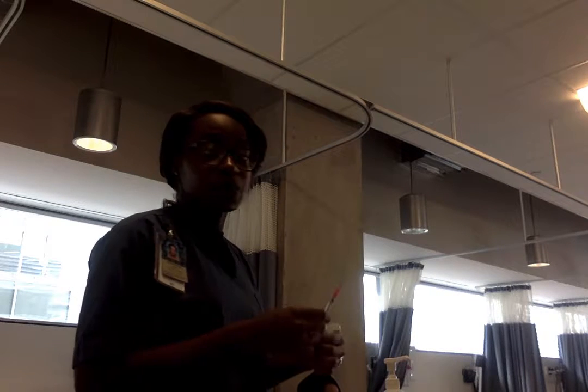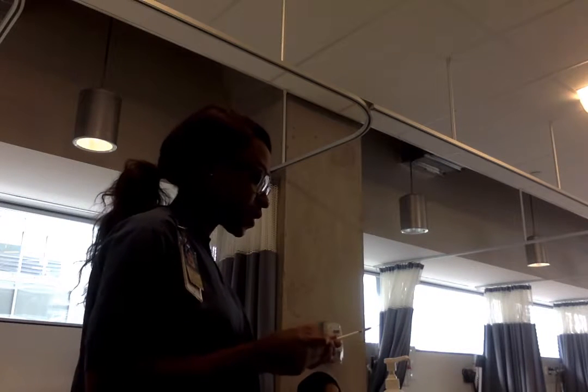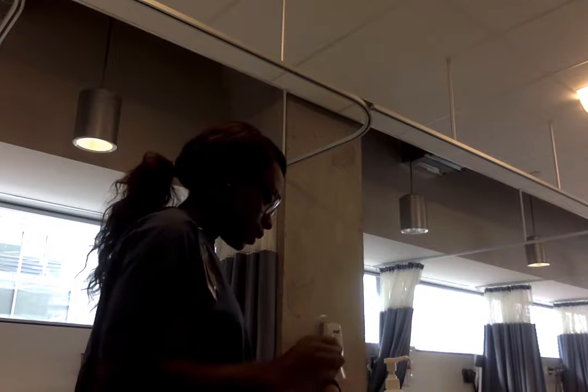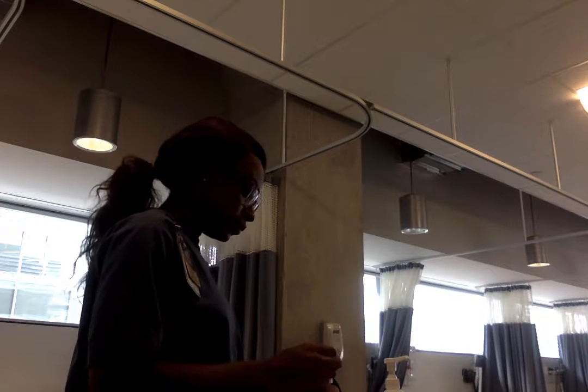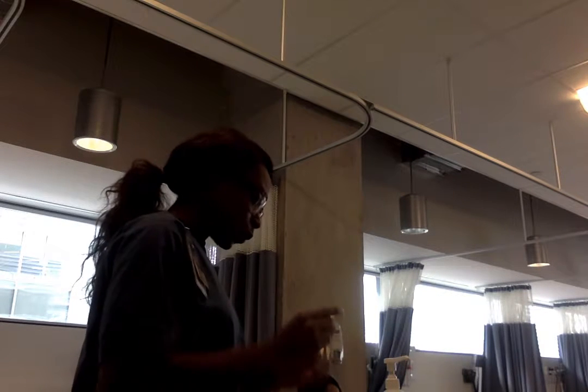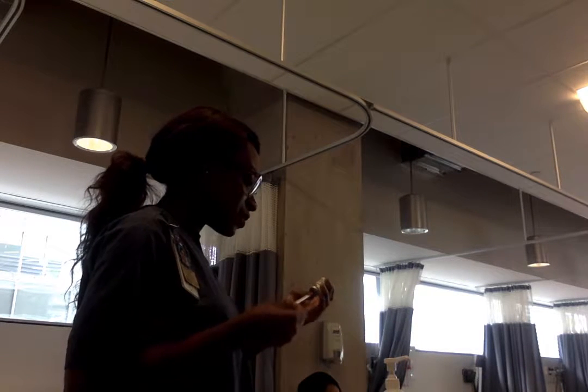And I know I have to take out 0.6 milliliters, so I will expel 0.6 milliliters of air into my vial, and I will withdraw 0.6.